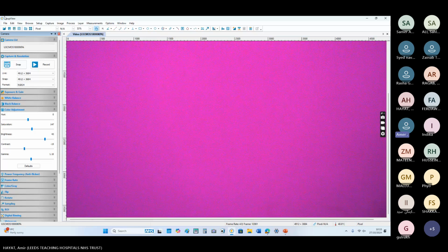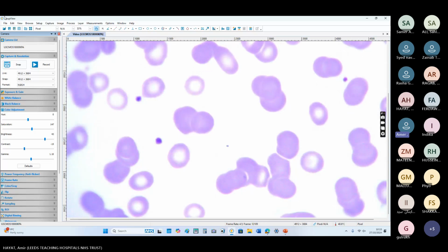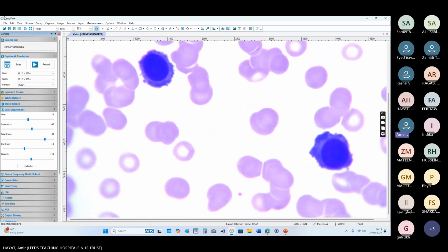You would think that either the initial diagnosis was wrong or the patient has now developed plasma cell leukemia, which cannot be possible. This is called spillover myeloma.